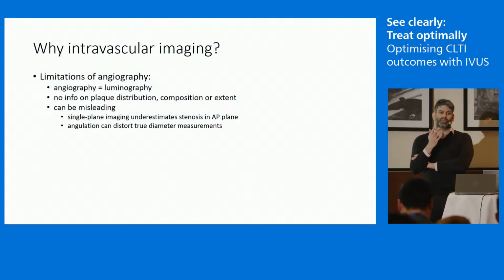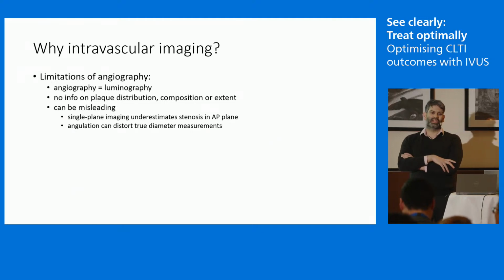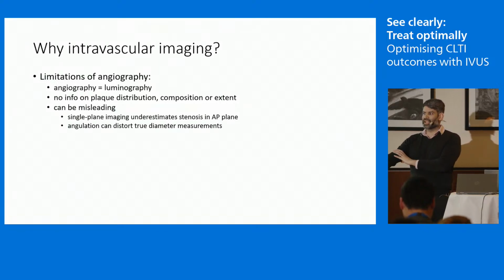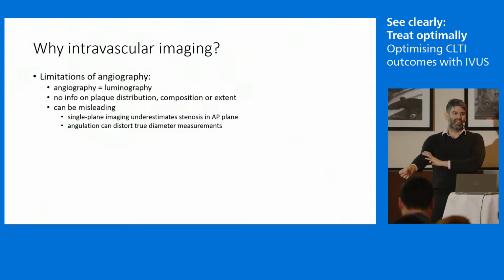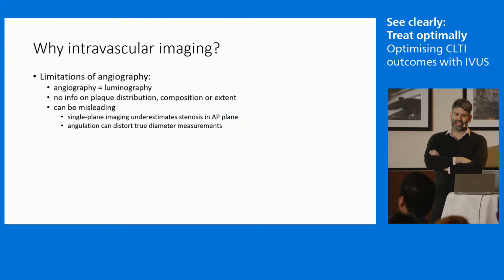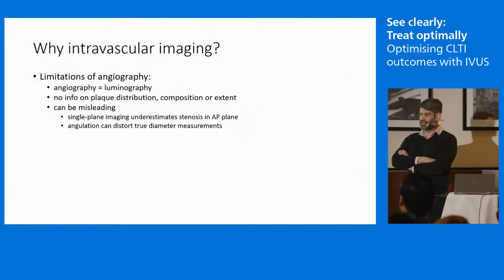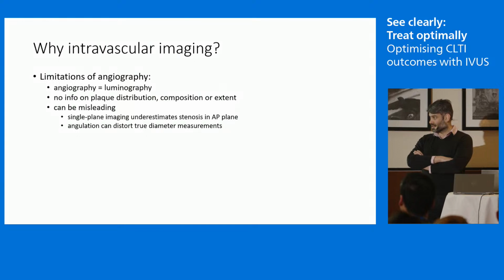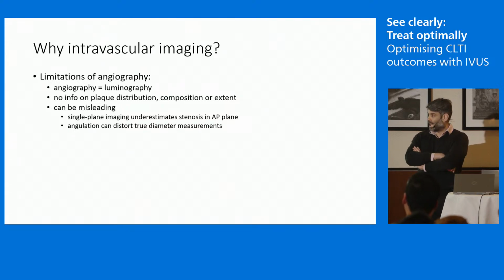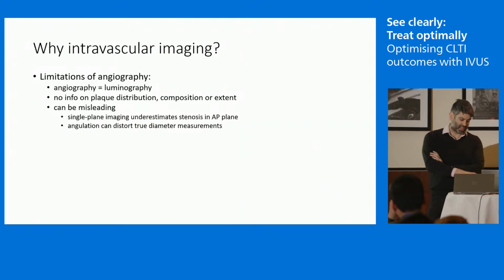So for 20 years, well, 15 years maybe, we've had this quantitative vascular analysis based on all of our fluoroscopy systems, where you put some kind of dummy guide next to the patient's leg and use it to give the machine a number to divide the diameter by on the screen and give you a rough diameter of what to expect from the vessel. And the more and more we use IVUS and compare that with the QVA measurements of vessel diameter, particularly as a vessel goes around a bend, you can see that these measurements are just not accurate at all.